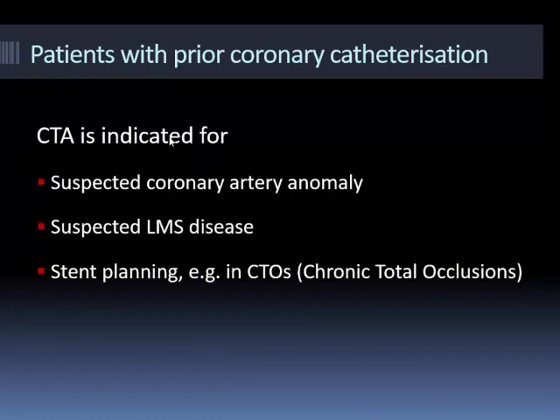What about patients who've already gone to cath lab? I kind of mentioned yesterday that where CT angiography can be helpful is in the visualization of coronary anomalies. You'll hear from the lecture following this that coronary anomalies obviously are not that uncommon and can be very challenging to understand in 3D when you're limiting yourself to two-dimensional pictures, especially when you're not seeing them all the time. So CT is great because A, the surgeons love it because you give them the anatomy, the surface anatomy, they can relate to that. B, you can really see the relationship of the coronary arteries with the various structures.